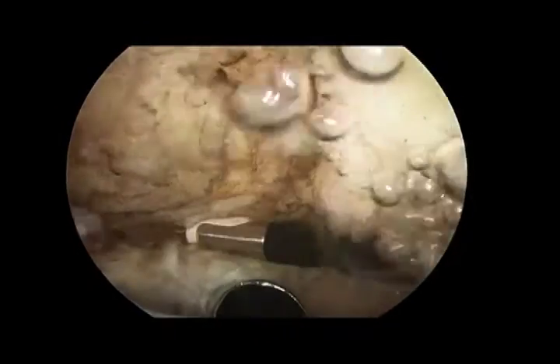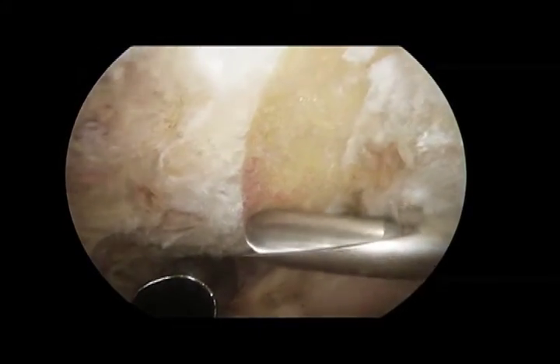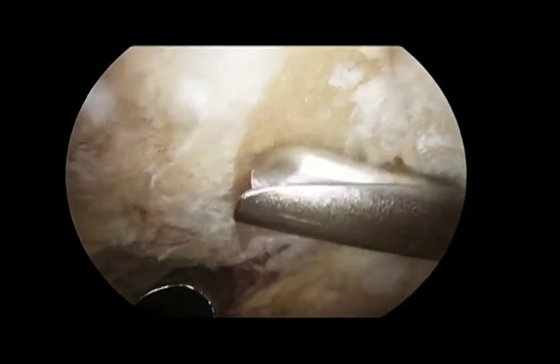Anteriorly and anterolaterally, the CA ligament is gently recessed away from the acromial edge, allowing for an accurate assessment of the bony architecture. Based on the preoperative radiographs, an appropriate level of resection of the anterior acromion is determined using the 5.5 mm burr as a guide. An orientation trough along the lateral acromion is gently tapered posteriorly to the level of the posterior AC joint.